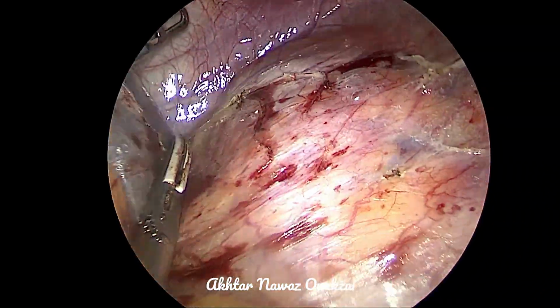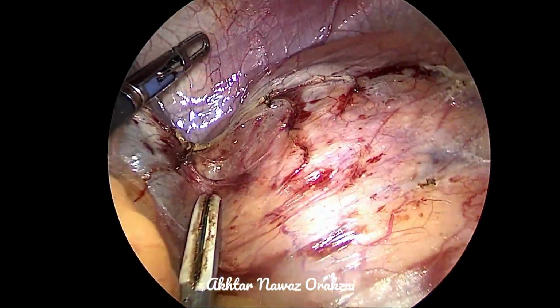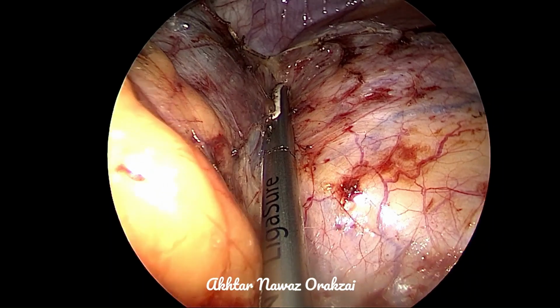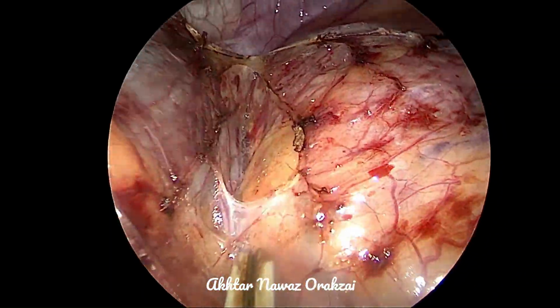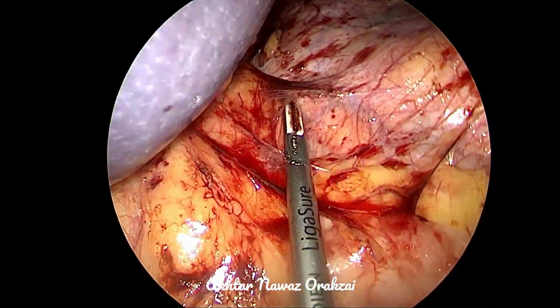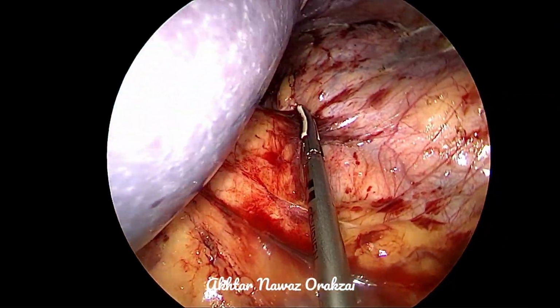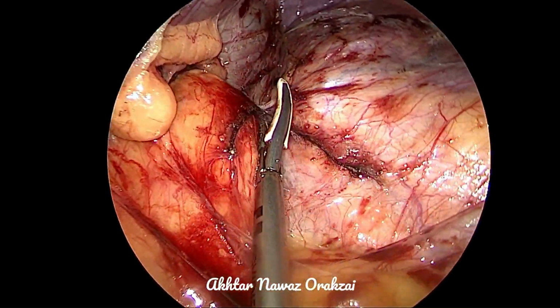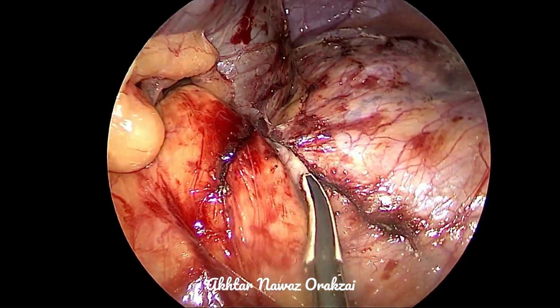It will drag the colon towards the midline or medially, and thus the area where you are working, that is the adrenal, will be very easy to dissect. So we are doing our homework here. We are preparing our battlefield.